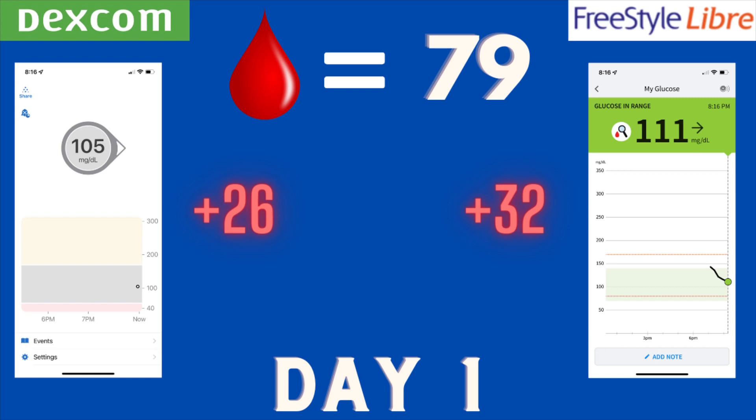Day two — finger stick showed 100, Dexcom was at 105, very close. The Libre was even better at 102, only two points off the actual finger stick. So we're past that first 24-hour period and accuracy is starting to improve. Both sensors were very accurate, though the Libre took a slight edge being off by only two points versus five for the Dexcom.